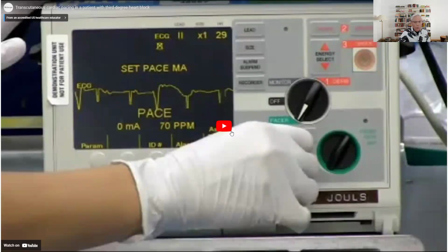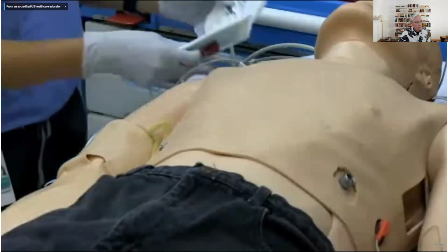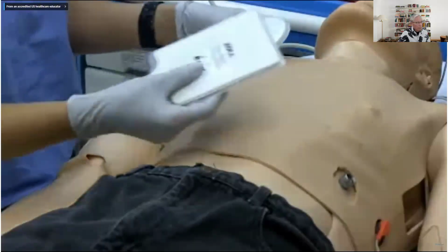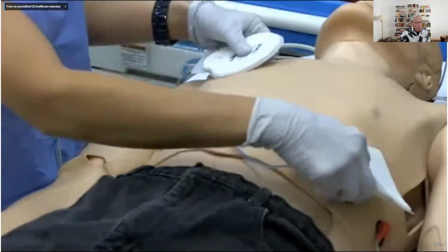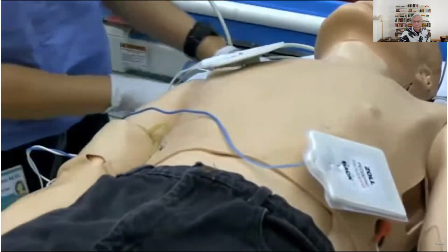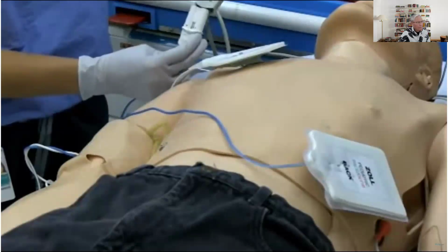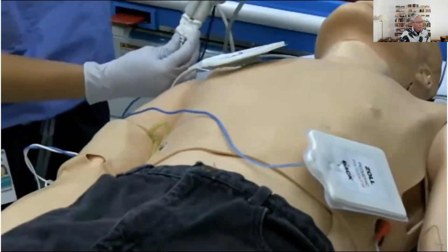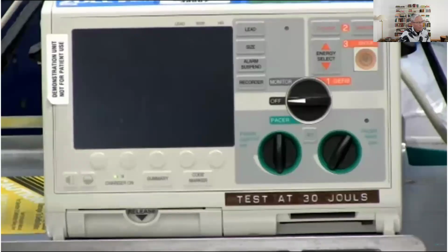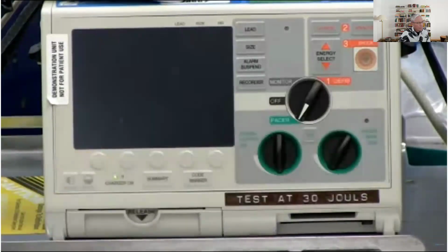Okay, just wanted to show you this film, showing you how pacing is done. Place the defibrillator pads on the right chest wall and lower left chest wall as indicated on the pads. Ensure that the pads are connected to the defibrillator. Turn the defibrillator dial to pacer or press the on button if available.